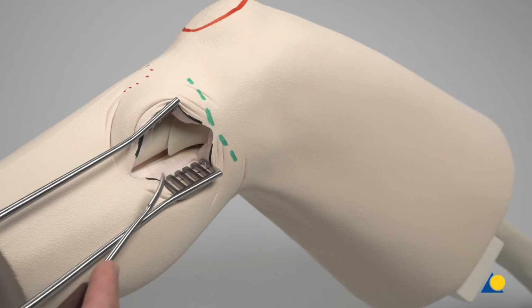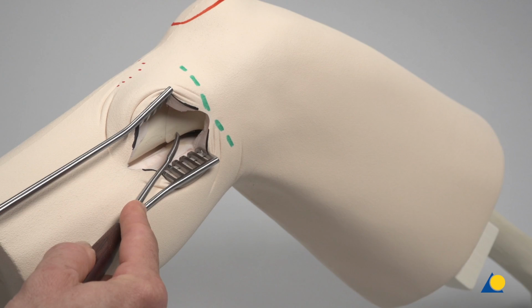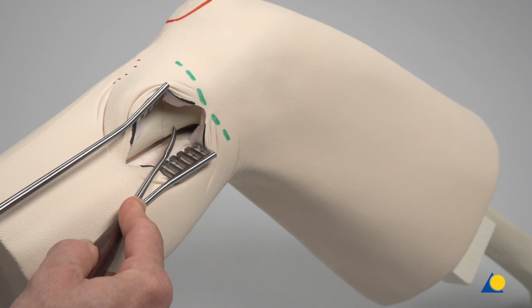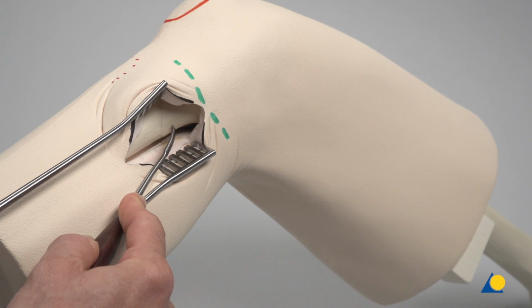After clearing the fracture gap, reduction is achieved by pushing the medial bone block upwards. Clinically, to achieve preliminary reduction, mechanical distraction, changing flexion of the knee, and a stab incision on the lateral side, followed by the application of a pointed reduction forceps, are often necessary.